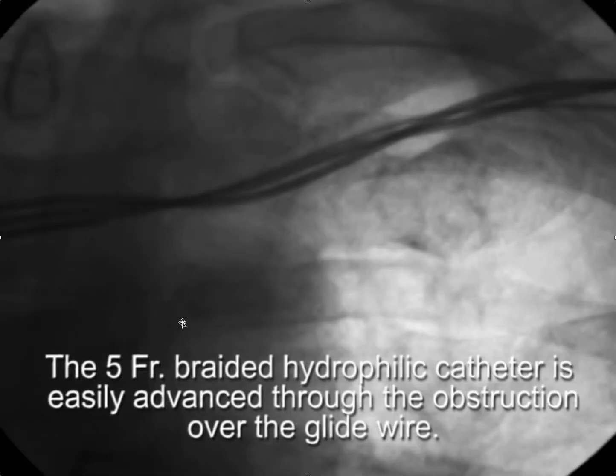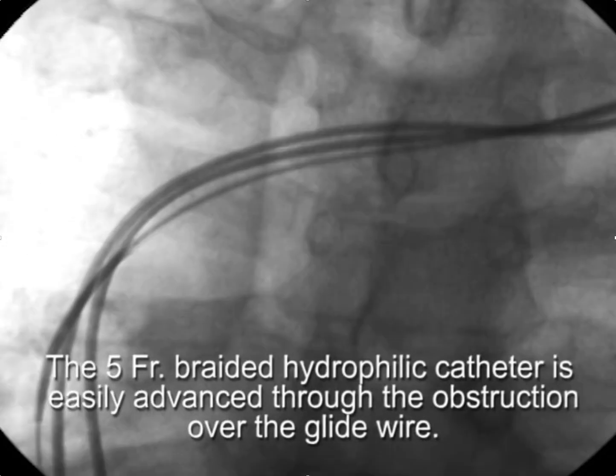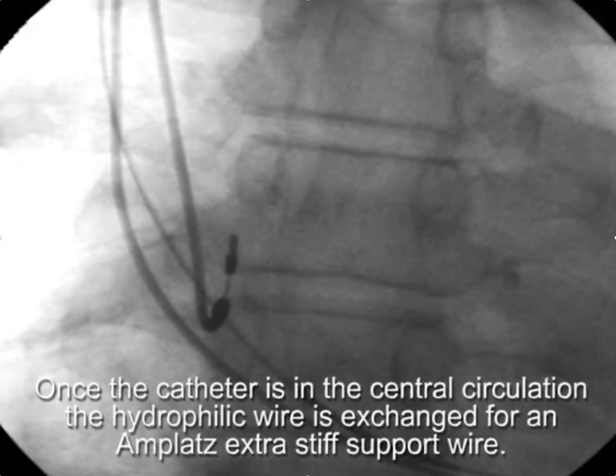What we're doing here is advancing this catheter over the glide wire. The features that allow us to do this are its pushability and the fact that it's hydrophilic, so the outside of the catheter is as slippery as the glide wire itself.